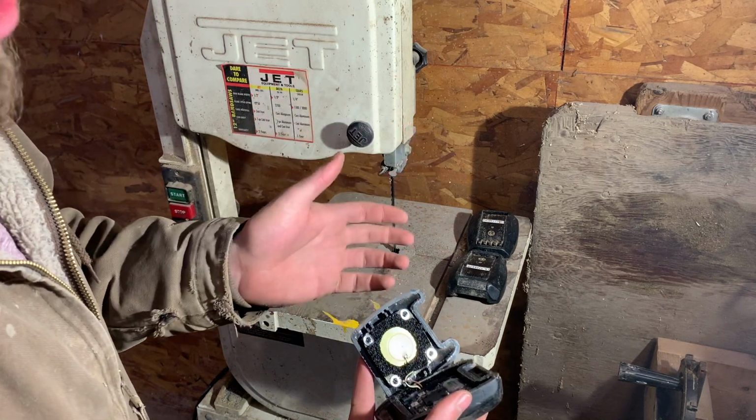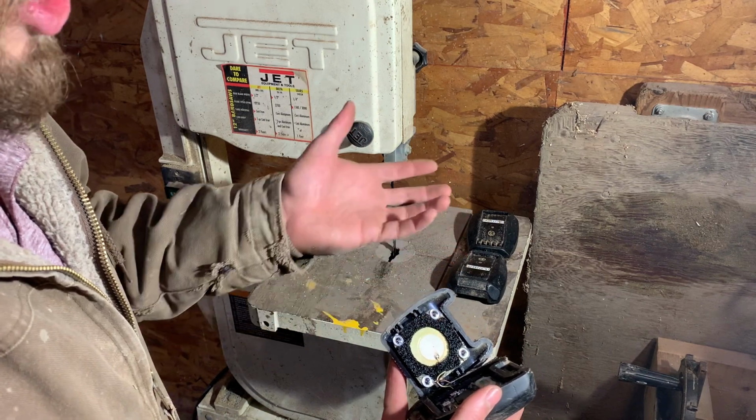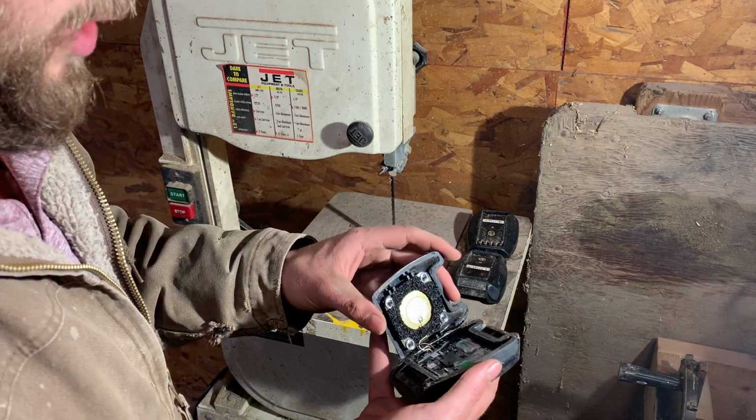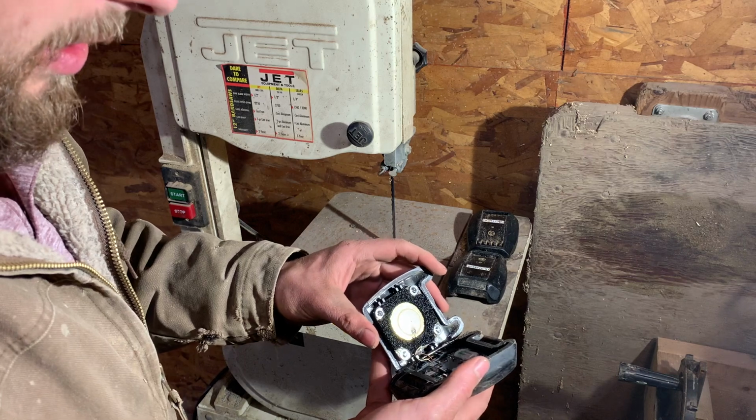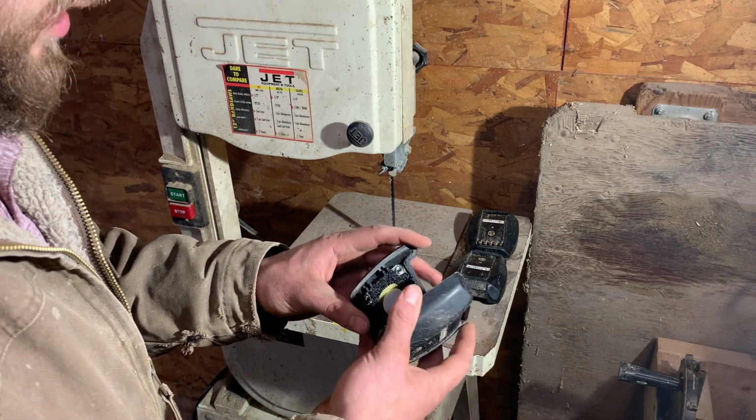If you hit the wires, you can try to fix them. I've just ignored it, because it's only for the rumination. Then your collar just won't have rumination, so it's not the end of the collar. It won't ruin it. If you hit the wires, you just won't have rumination if you don't fix it.